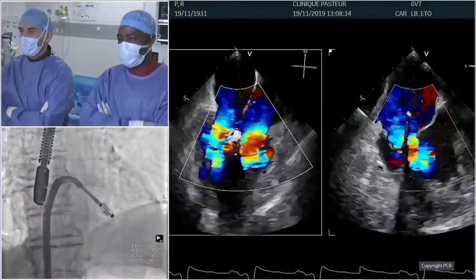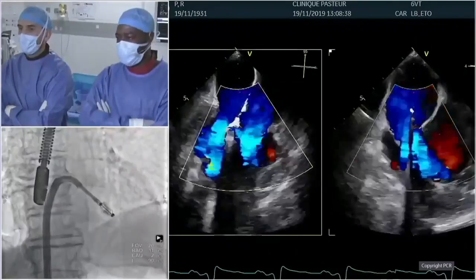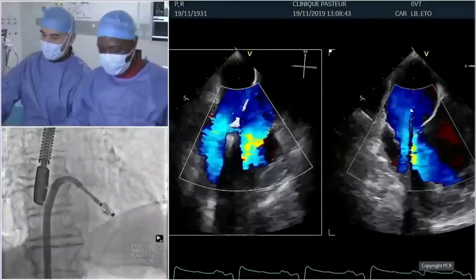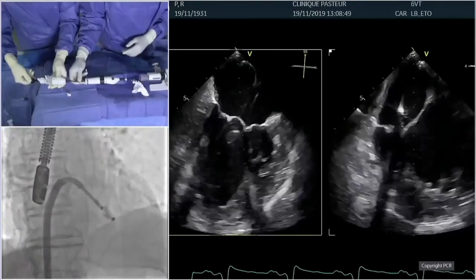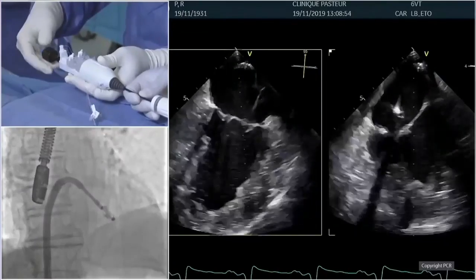So if you keep this, it's okay, but you're going to have to put another device in next to it. The other option is just to move it over a little bit more lateral. We're going to optimize. Go back to LVOT, please. Stay in X-plane without color. So we're going to try to optimize the position. Open, capture ready.